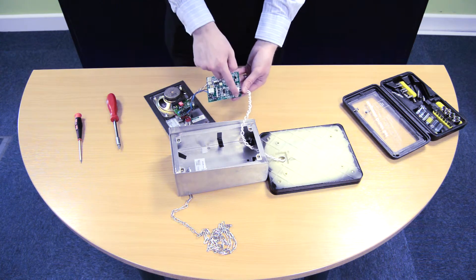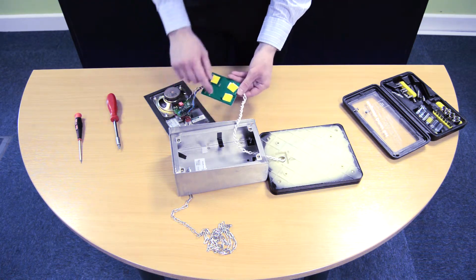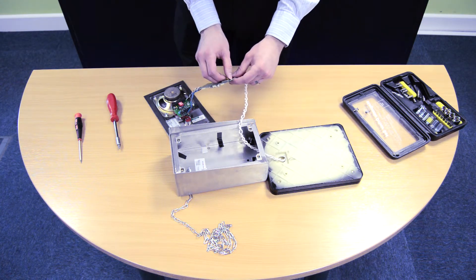Mount the unit via the four mounting points on standoffs, or alternatively you can use sticky back, and that's what I'm going to be using just now.